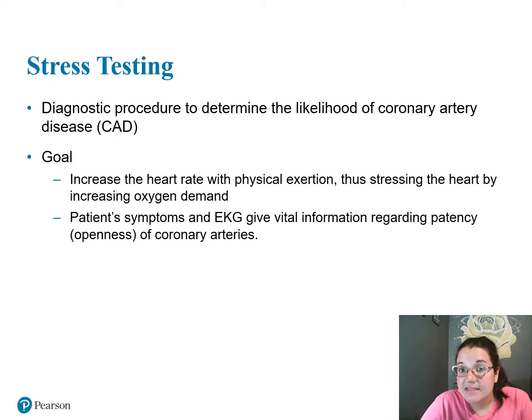All right, the next type of test that we can do is called your stress testing. This is a diagnostic procedure to determine the likelihood of coronary artery disease. There's your abbreviation again, CAD. Whenever you see CAD, they're not going to spell it out for you on the question. They're going to ask you, do you see any signs of CAD in this rhythm? Coronary artery disease. The goal of a stress test, this is very important, and this is a lot of your quiz and homework questions.